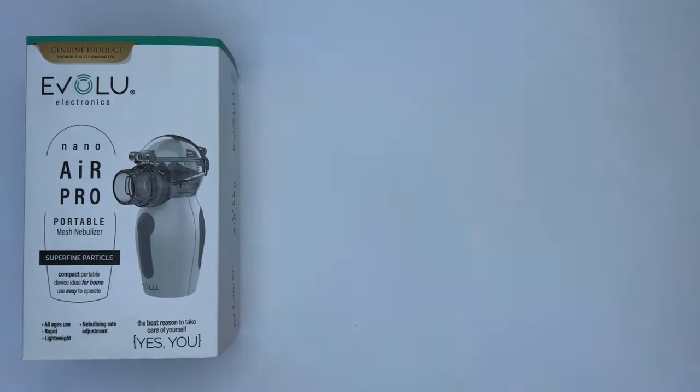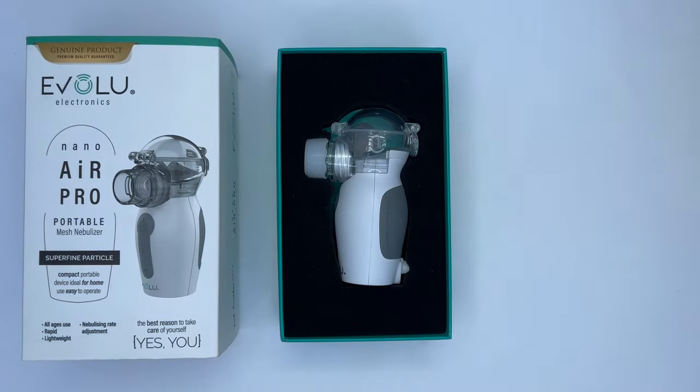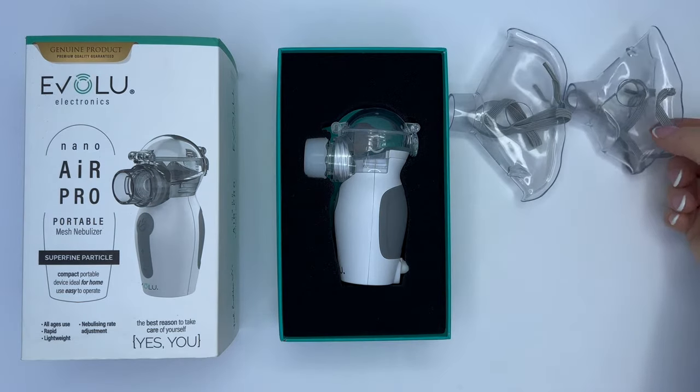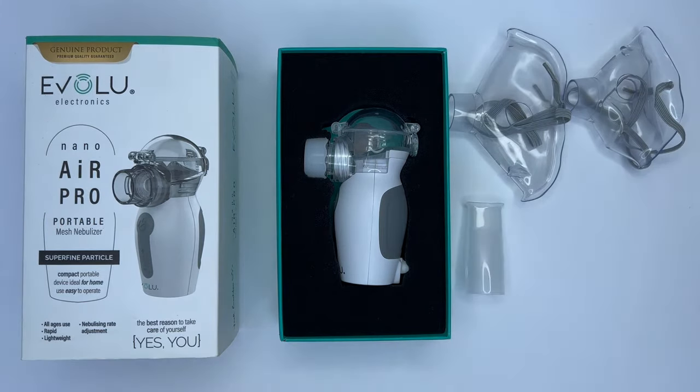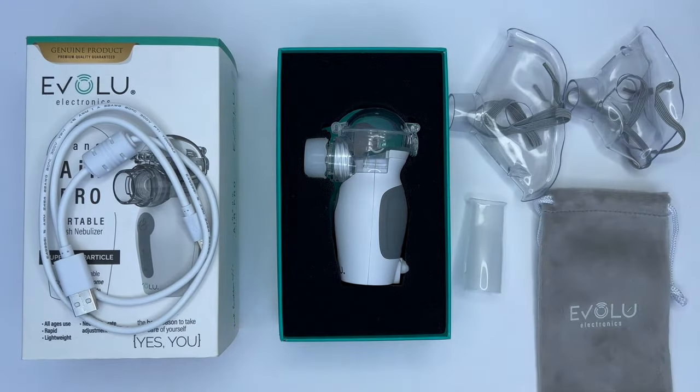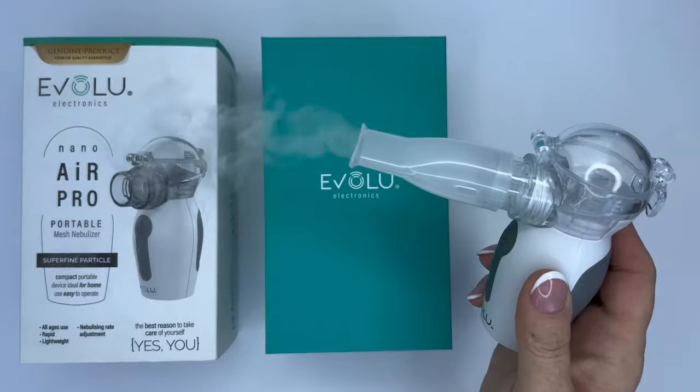The kit includes the device itself with a convenient medical cup, two masks for a child and an adult, a mouthpiece, a USB cable for charging the device, and a storage bag.